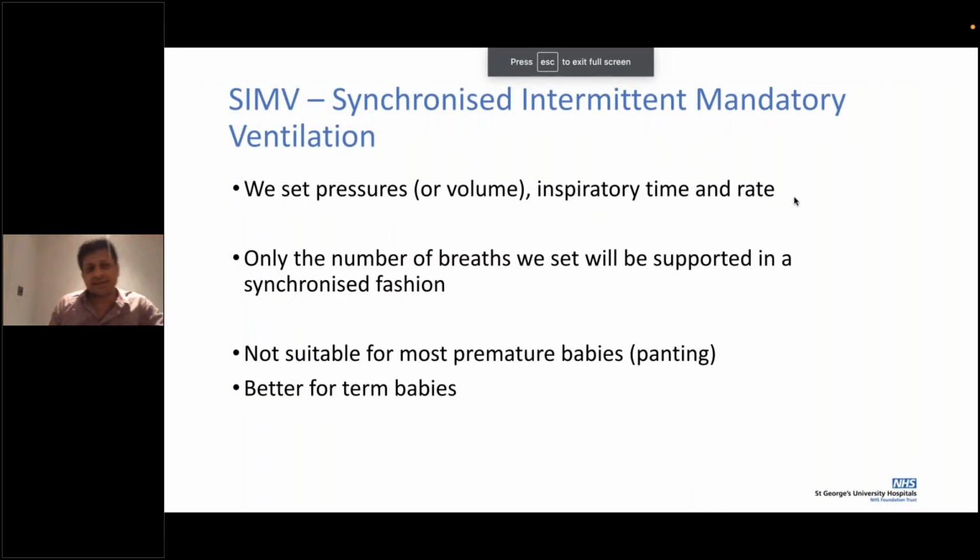So what is SIMV mode of ventilation? Really, it's more about a baby who's slightly bigger. You're getting overventilated breaths. Already your CO2 is low, but for whatever reason you still have to keep this baby ventilated. In that case, you don't want all the breaths taken by the baby to be supported. You want the baby to actually make an effort to sustain that pressure needed to have an effective gas exchange. So whatever rate is set on the ventilator, only those breaths are supported by the ventilator.